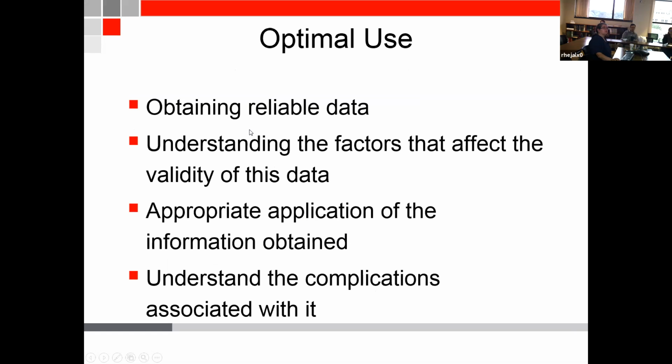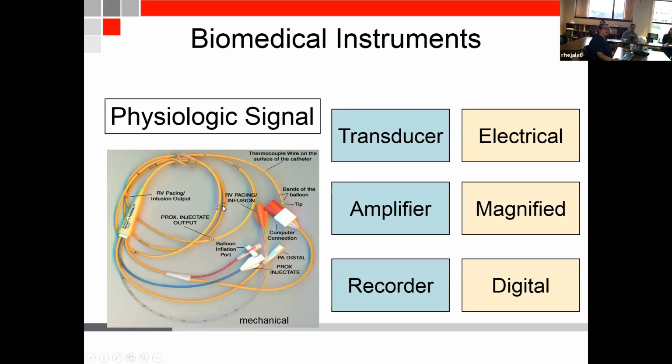Optimal use needs optimal application of it. This is just for you who are going to place a few of them, and Nick, you're not going to place many, but you're going to see a lot of patients with pulmonary hypertension who will have it placed in the cath lab. When you are with a patient with pulmonary hypertension, advanced pulmonary disease, you'll be able to at least go watch them. We do few.